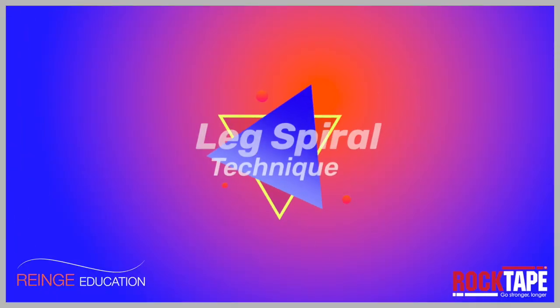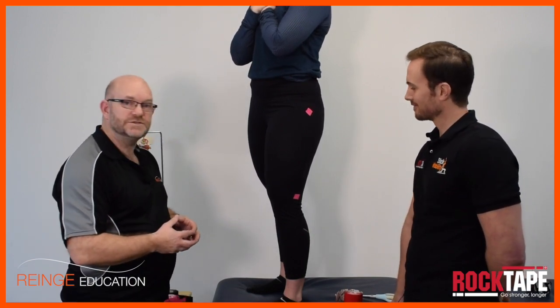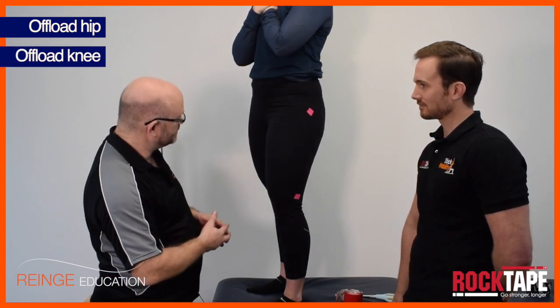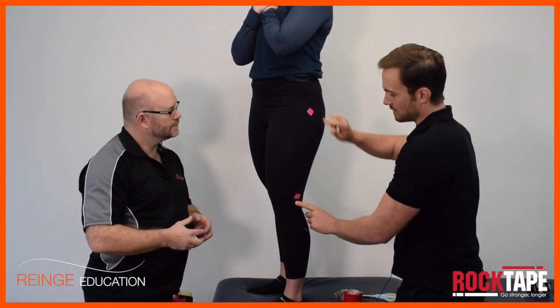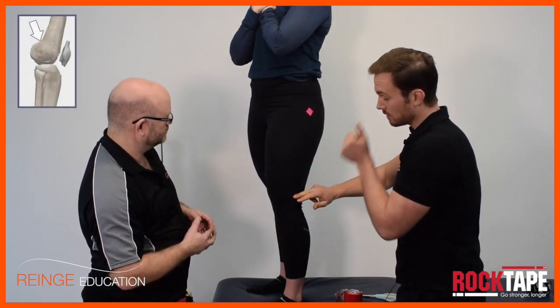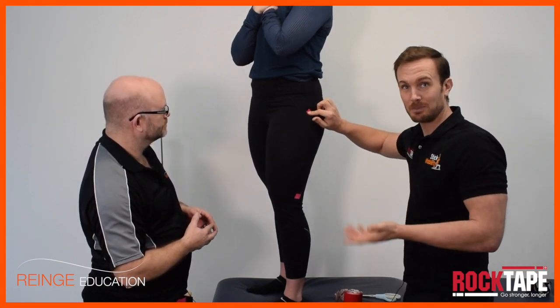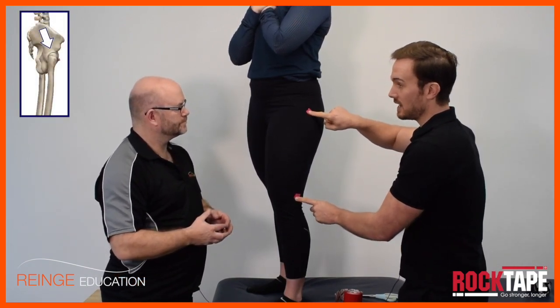Dan's going to show us what's called the leg spiral. This is useful for offloading problems around the hip and also around the knee. We've got a couple of marks here — the first one is the ITB pain over the femoral condyle, the runner's knee we were discussing, and the other one up here is for lateral hip pain, which people commonly refer to as bursitis but often goes by the name of greater trochanteric pain syndrome or gluteal tendinopathy.